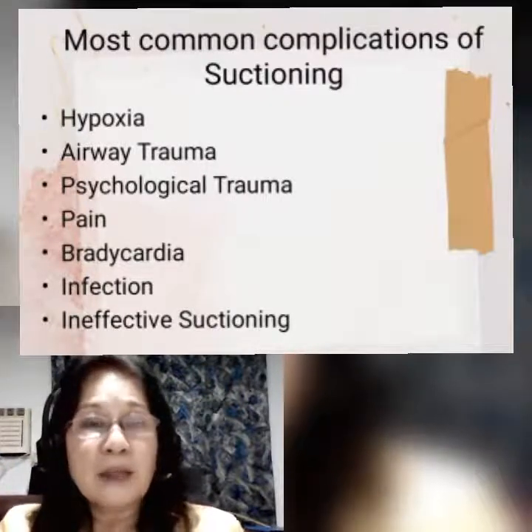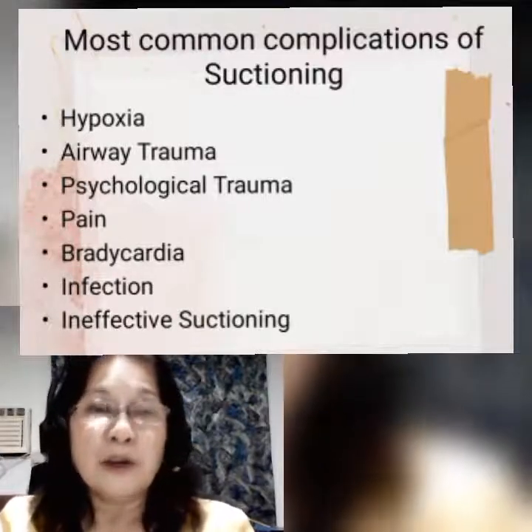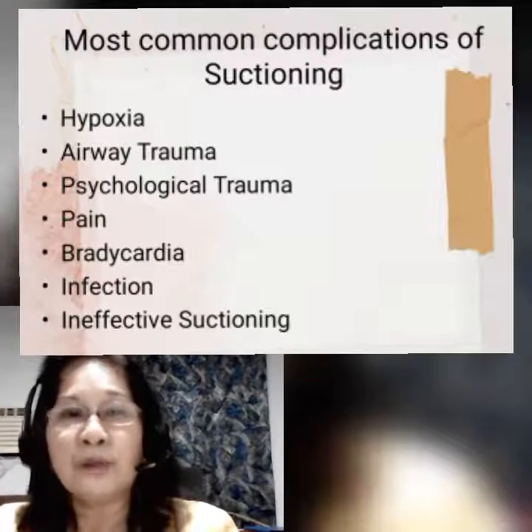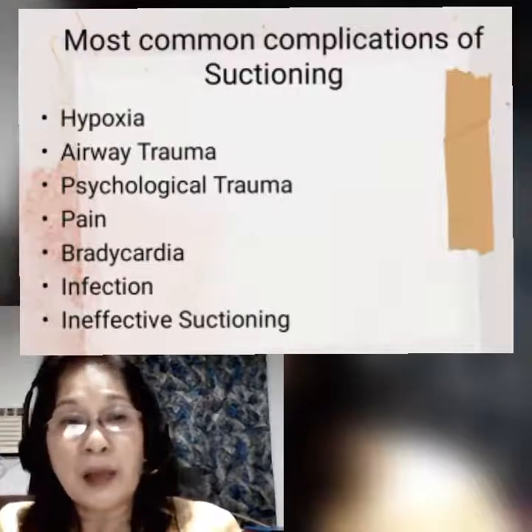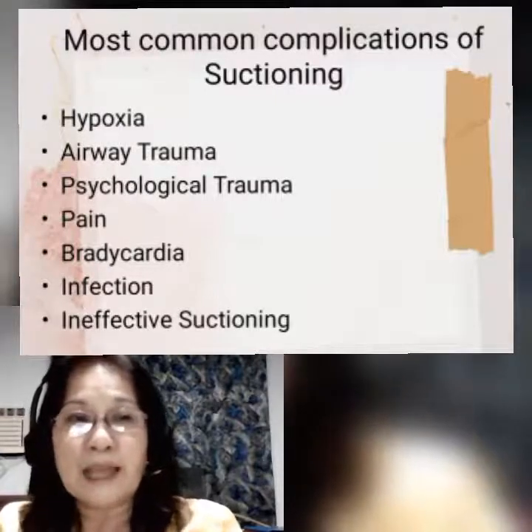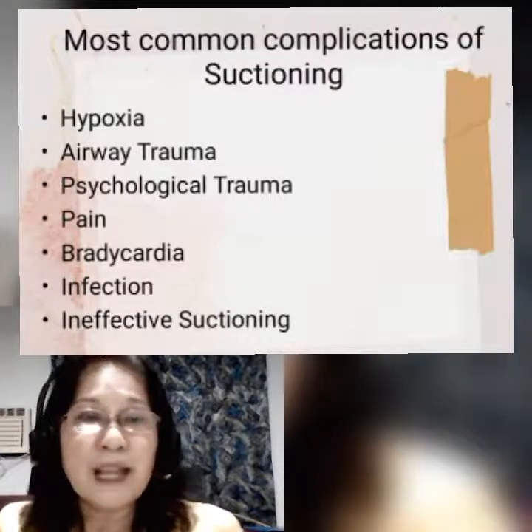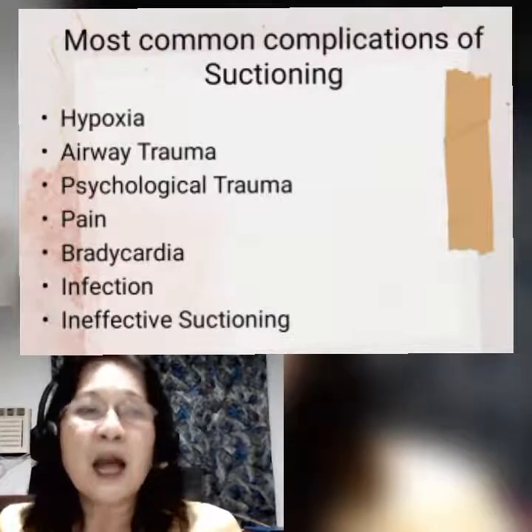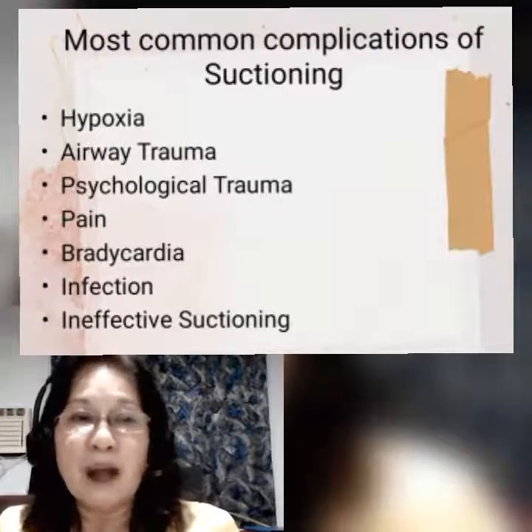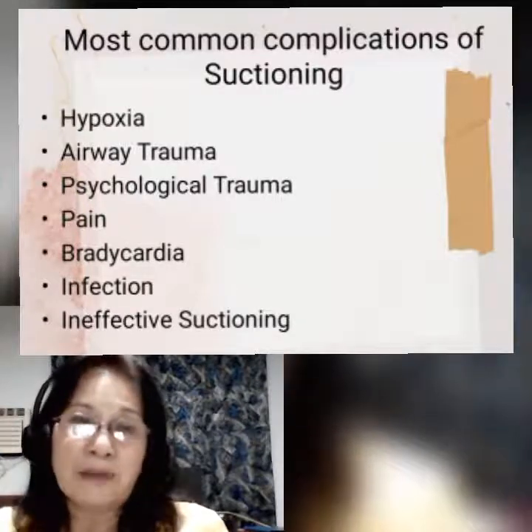Psychological trauma, all right? Patients during suctioning should be properly oriented. "Sir, I'm going to do suctioning on you. This is quite painful, but you have to be patient because it is the procedure that will help improve your condition." Try to reassure your patients and reduce their level of anxiety during these procedures. Then pain. Of course, it is very uncomfortable for the patients. Try to evaluate the pain scale of the patients while you are suctioning.